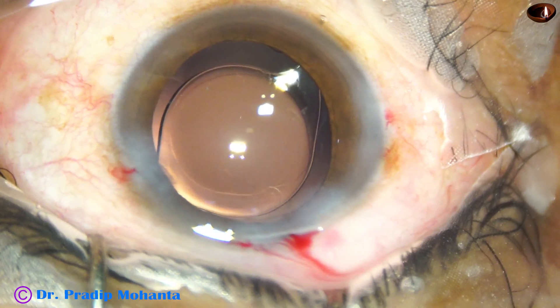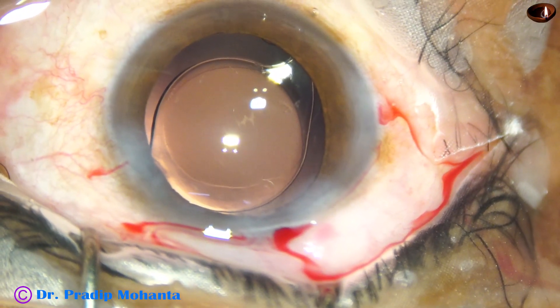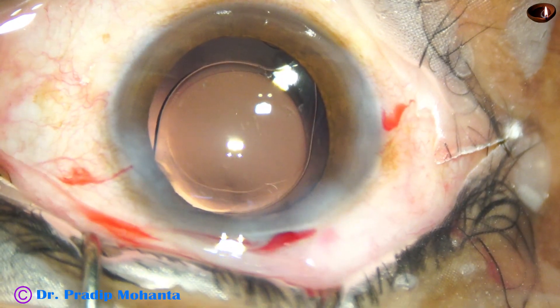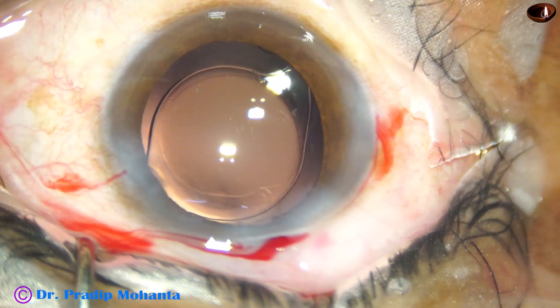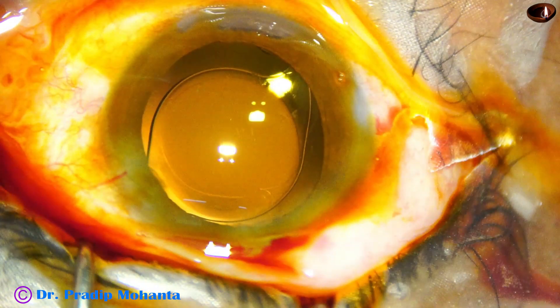Now this is the final lavage and formation of the anterior chamber by the Szynski hook itself. He is going to check whether the wounds are okay, whether there is any leakage from anywhere. No leakage. He puts a drop of 5% povidone iodine and concludes the case.